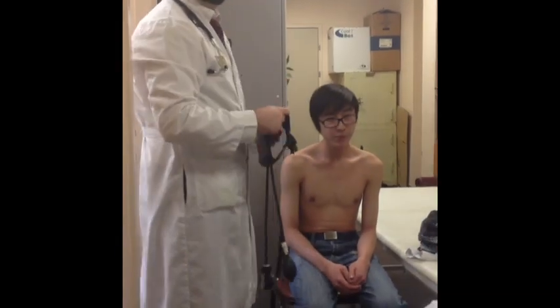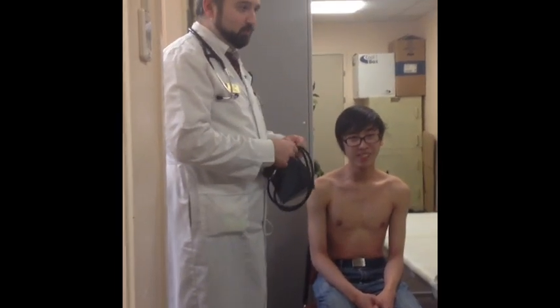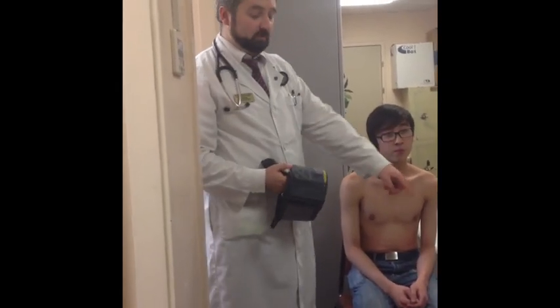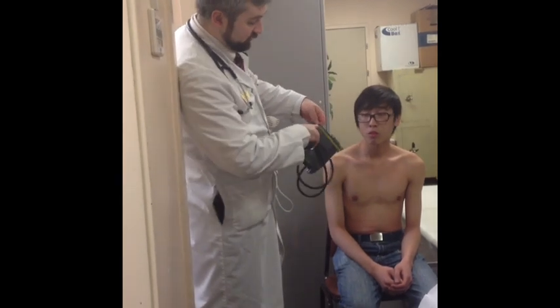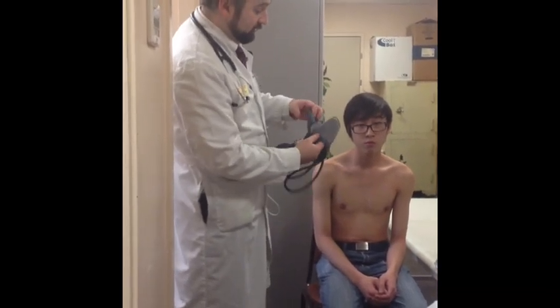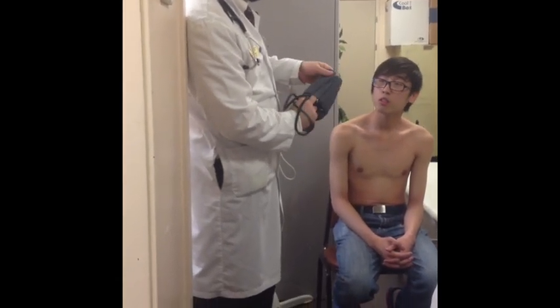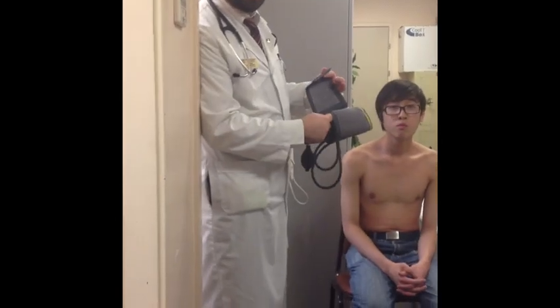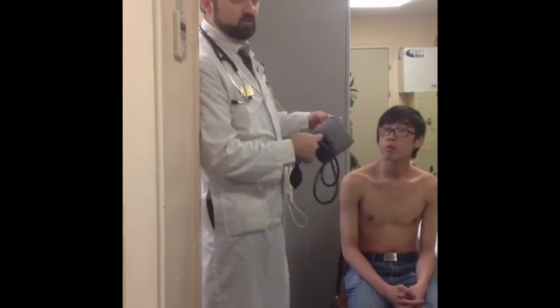The adult cuff begins at 25 cm. If you don't have a measuring tape, you can use the cuff itself — apply it and the index must reach the yellow line or colored line. If it goes beyond that line, the cuff is too big; if it falls short, the cuff is too small. Usually there are three sizes: small, medium, and large — one of these should be suitable for any patient.